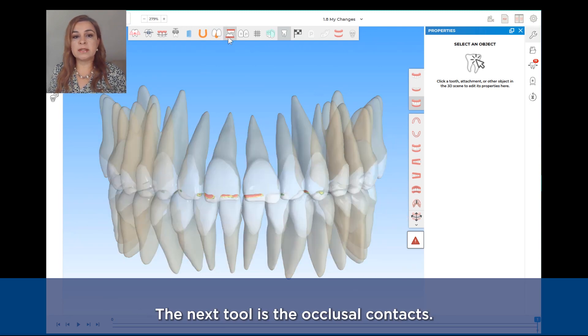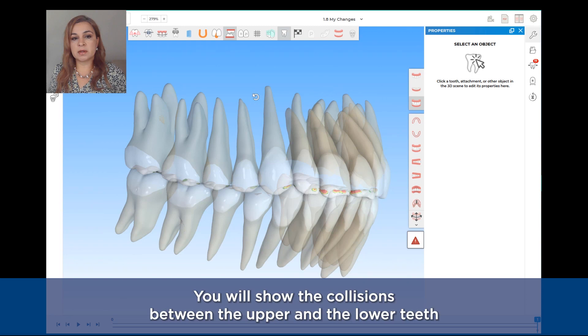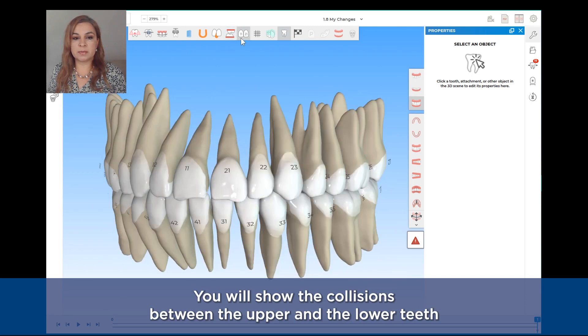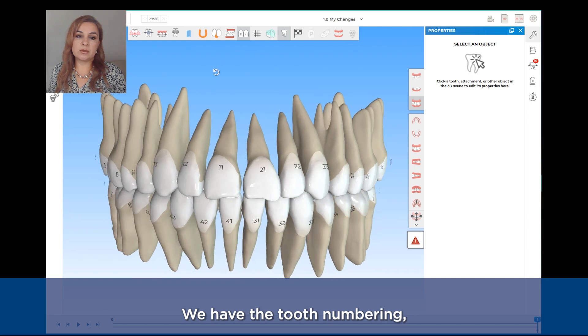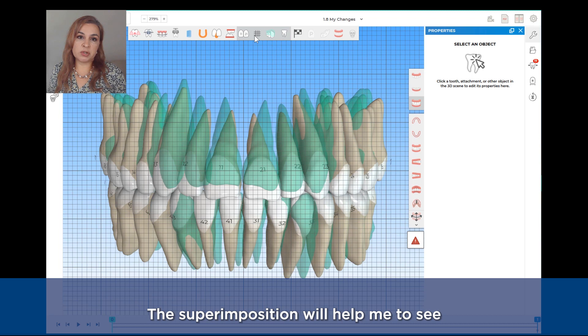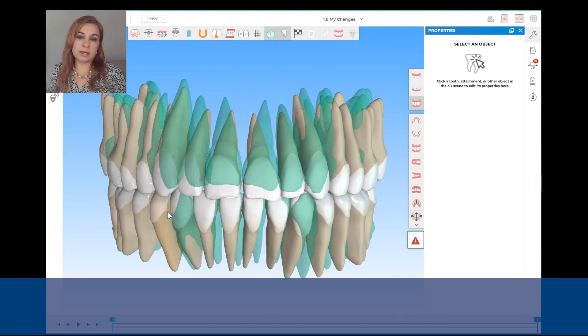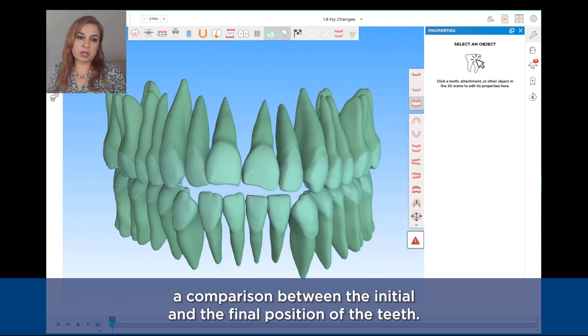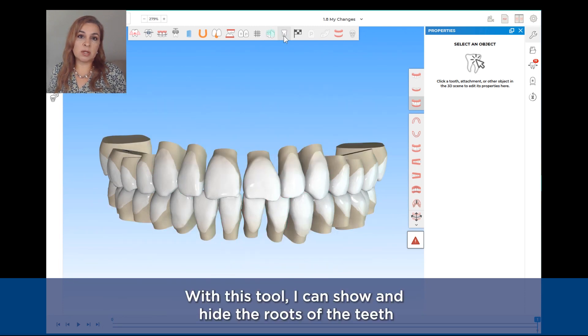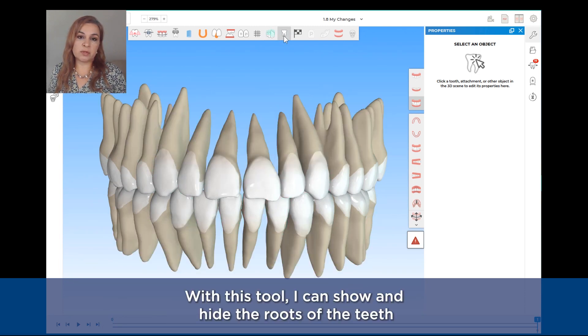The next tool is the occlusal contacts — it will show the collisions between the upper and the lower teeth. Following, we have the tooth numbering and the grid. The superimposition will help me to see a comparison between the initial and the final position of the teeth.